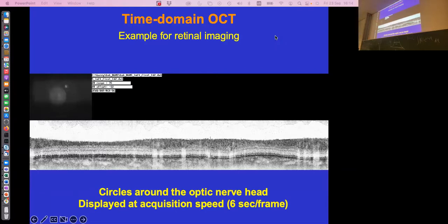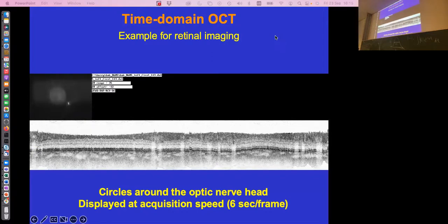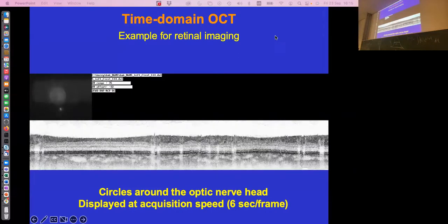You can see every time it's completed in this image, but what kind of things do we see here? Well, this here is the photoreceptor layer, inner plexiform layer, outer plexiform layer, inner nuclear layer, outer nuclear layer, nerve fiber layer. And you can see blood vessels. This is a blood vessel; because the blood vessel absorbs the light, it casts a shadow in the deeper layers. In this image, black is a strong signal, and white is a very weak signal.